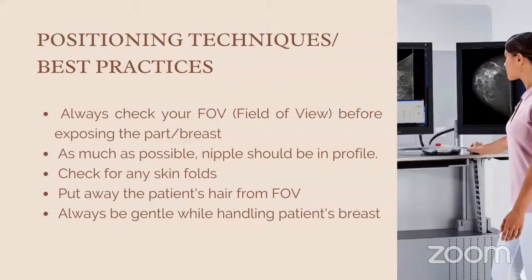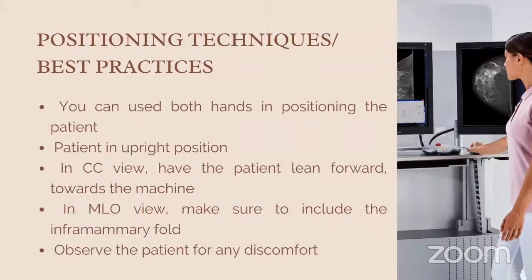Put away the patient's hair from your field of view because it can be an artifact to your image. Next one, always be gentle while handling the patient's breast because most of the time it is one of the sensitive parts of the body, especially in women. Another tip is you can use both hands in positioning the patient so that your movement will be more flexible.